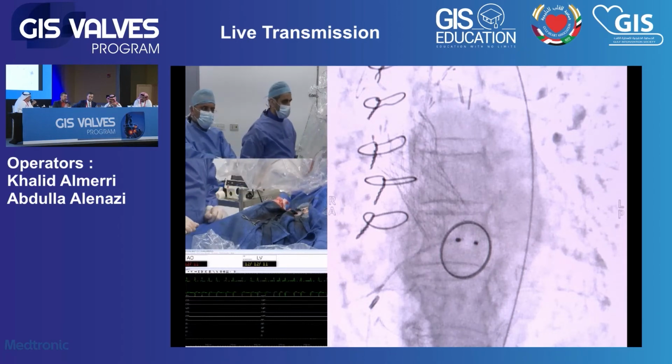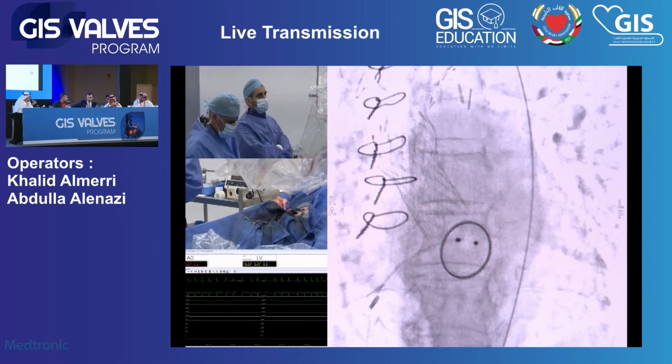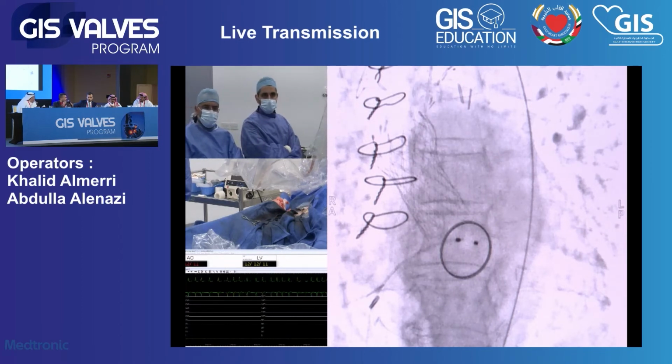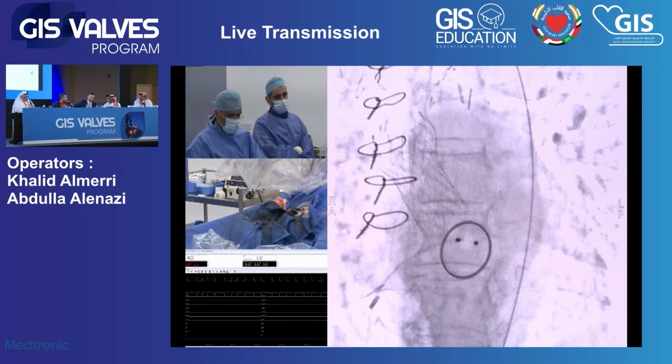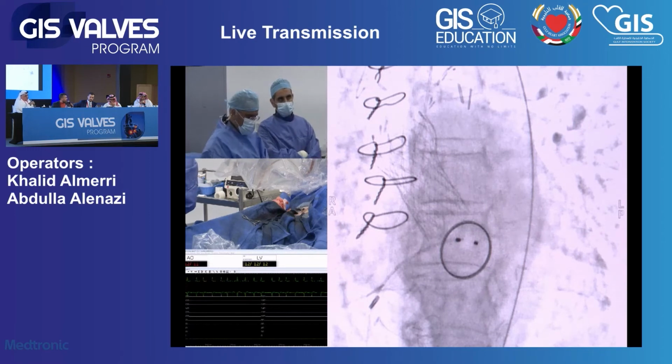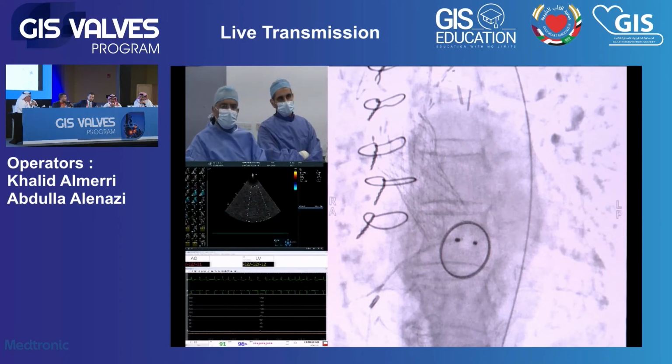style. Actually, from my point of view, it makes a big difference in your outcome, especially for vascular complications, because sometimes you will not recognize a calcification and you puncture in a calcific spot. If you go just 1 centimeter above, it will make a huge difference. Yes. And the tip here, as Dr. Muhammad said, is that you should use it not only for TAVI cases or femoral approach cases, and even for radial sometimes we use it. So you get more used to using ultrasound guided.